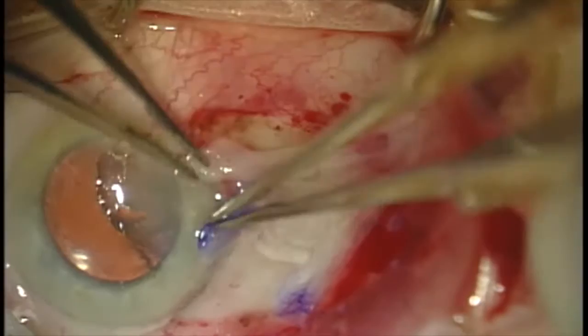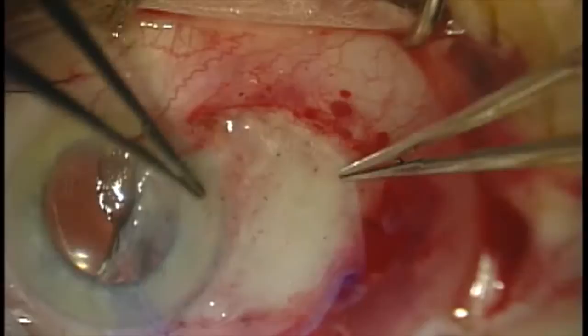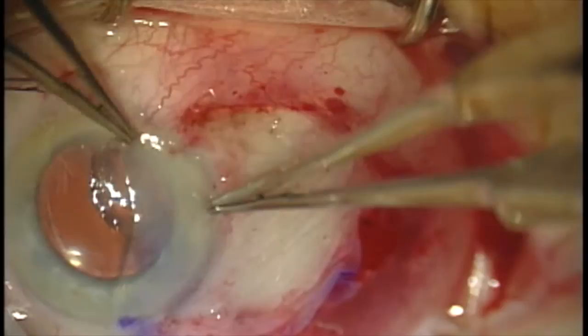Now we have the stroma side down again. The tricky part with the amniotic membrane graft is trying to keep the orientation and keep it from bunching up on itself. Here we're using two non-toothed forceps to just unroll the graft, and then we'll bring it into the correct position in just a moment.